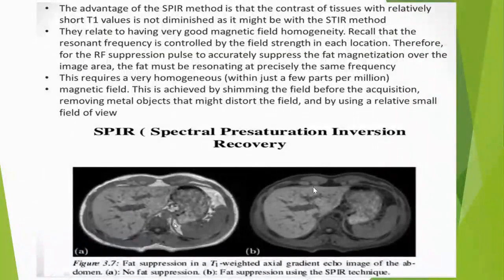You need a high magnetic field and a more homogeneous magnetic field because you want to differentiate between the frequency of fat and the frequency of the hydrogen in water present here. This difference is not considered significant, so you need a very strong magnetic force to initiate the signals inside the patient's body. Why is the signal from closed MRI better than that from open MRI? Because the magnetic force is higher.